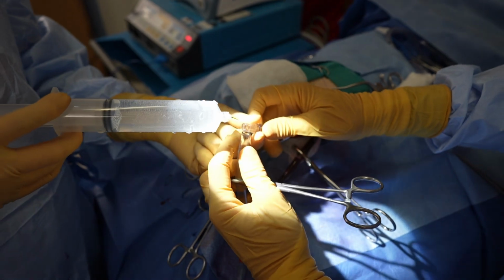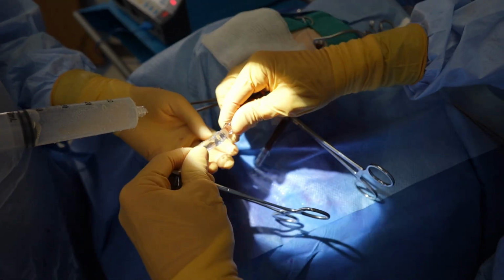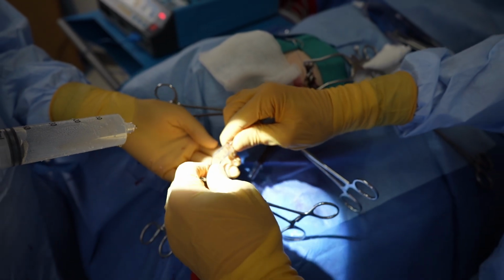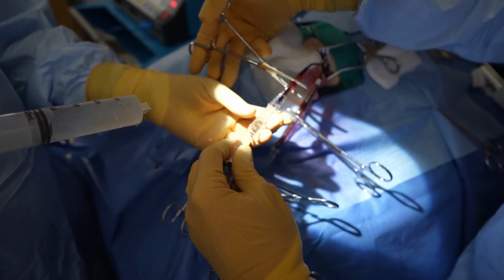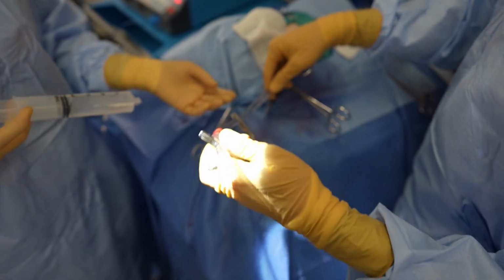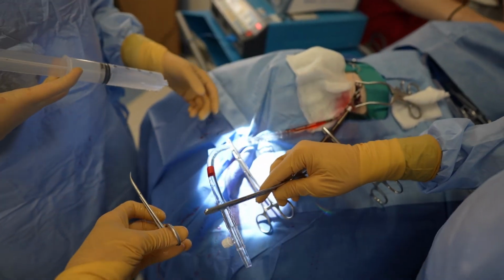Now we will connect our cannula to our ECMO circuit tubing with one of our surgeons controlling the tubing and cannula and the other inserting saline into our connection area in order to get all of the bubbles out. We perform a wiggle maneuver in order to wiggle the tubing onto the cannula while getting it in place. We want to make sure we put no tension on the cannula while doing this portion of the procedure because a cannula can be pulled out of the vessel until it is finally secured.